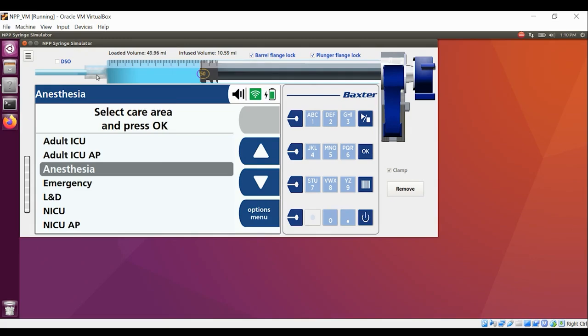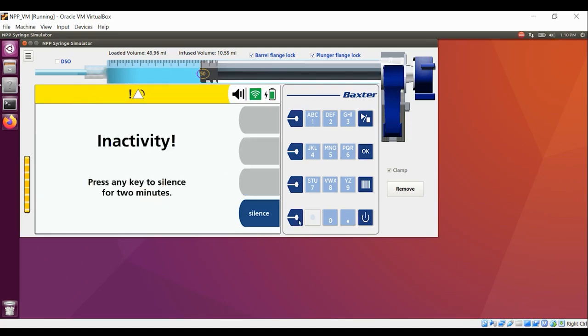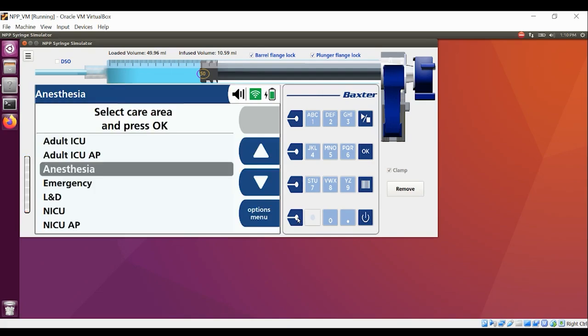Still very low, 2 mLs, but it's a little higher than our microbore and mini bore set, just so that they don't get those nuisance alarms in situations where they have to stop and reprogram. That will just drive them crazy, and it's something that we want to always avoid. So go ahead and get yourself some high flow sets.